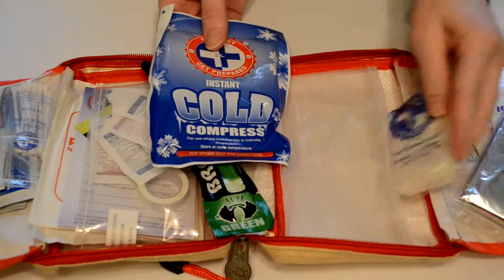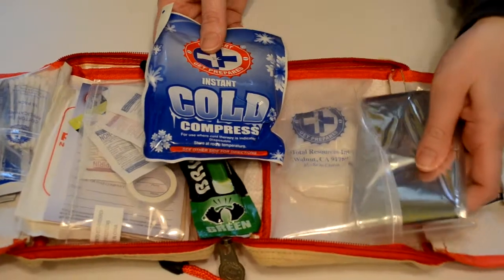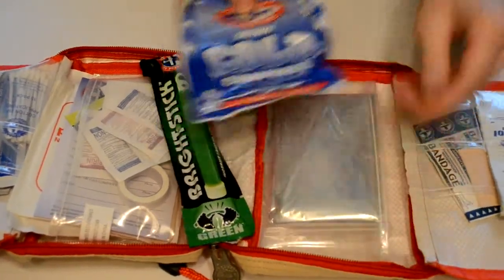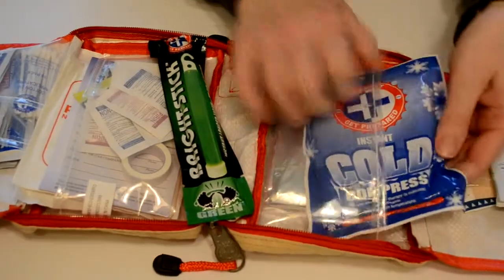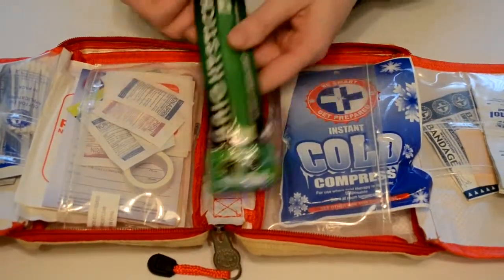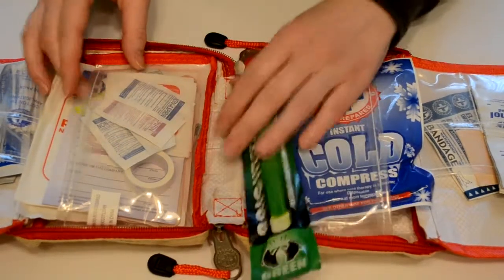The gloves are in case you're working on somebody else that's cut and you might need a pair of gloves. It's always a good idea to use gloves if you're handling anything that might have blood on it that's not your own blood. We've got a glow stick — you break it and it glows green — that's good for emergencies at night.